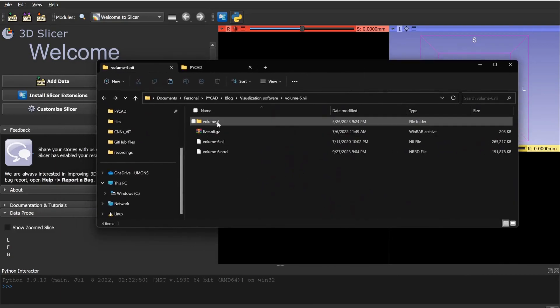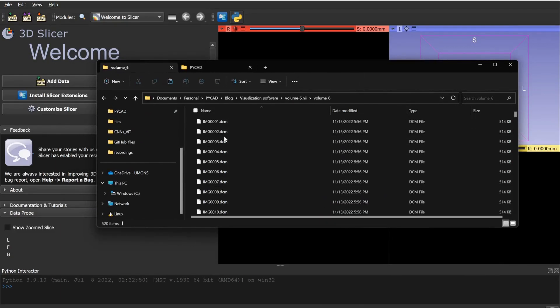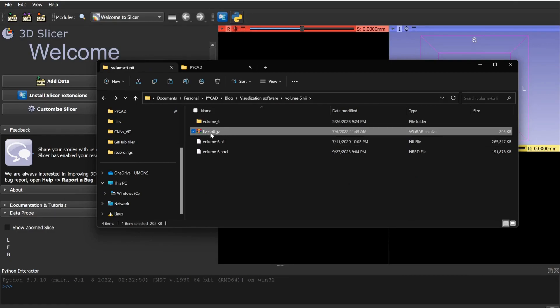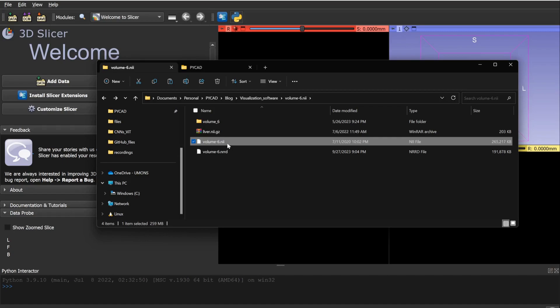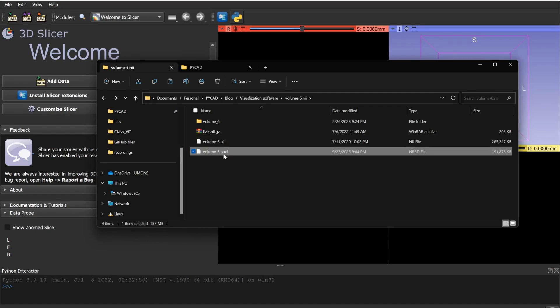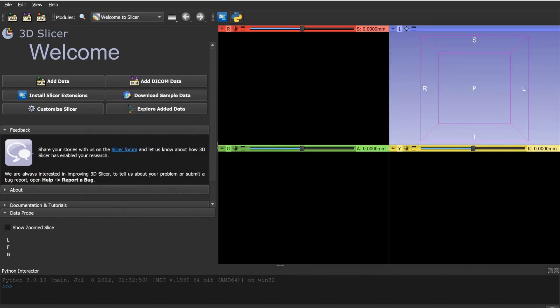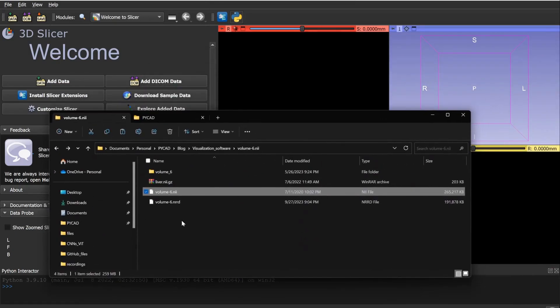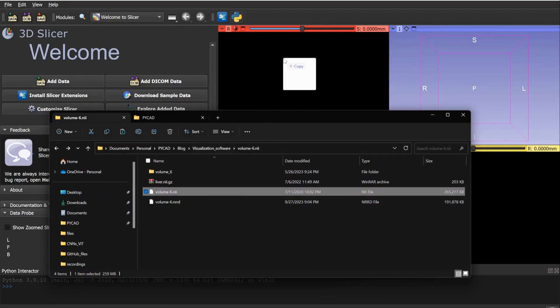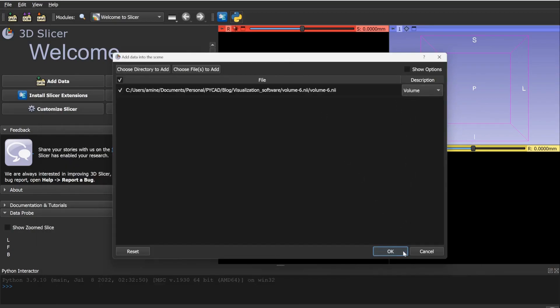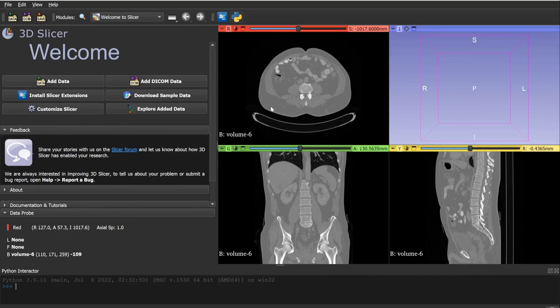I have prepared a dataset for this tutorial. I have a folder containing DICOM files, a segmentation file that we can convert into STL, a volume NIfTI file, and the same volume as an NRRD file. Let's start with converting from NIfTI to NRRD. To open the file, you simply drag and drop it here and select it as a volume.